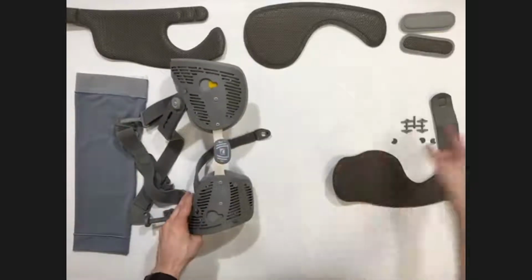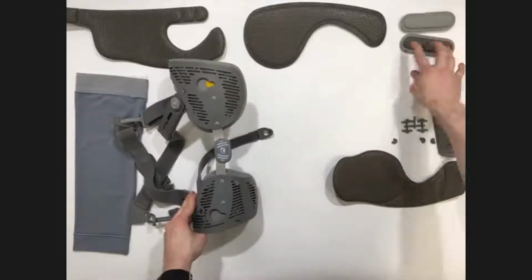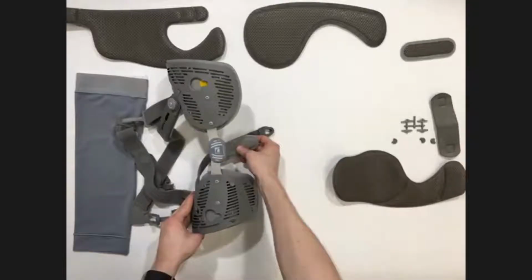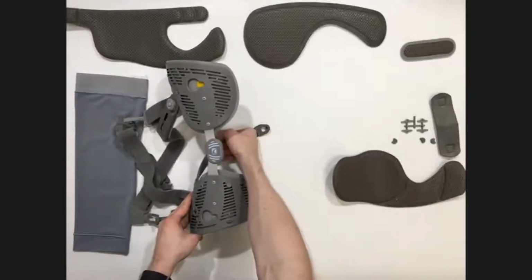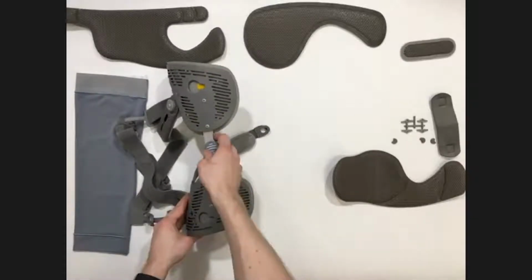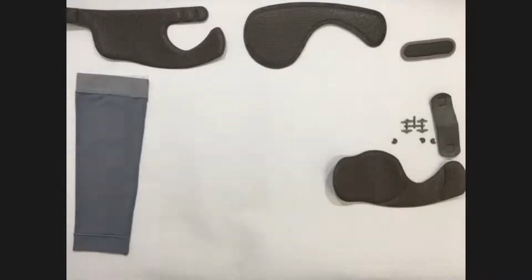We also have a pad that we can add to this. There's either a Sensil one or there's a doeskin one. In this case, I'm going to use the doeskin one, place that into position just so that we can fasten that. Okay, so we're going to bring this round and then fit this on Pete.